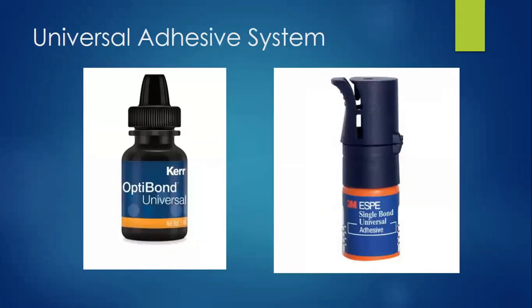Now we have the universal adhesive system. The trend in adhesive technology is to simplify, either by combining etching and primer bonding, or all in one, by reducing the application steps and shortening the clinical application time. So the aim is to provide a single product for all situations. It can be applied with etch and rinse or self-etch. It allows the clinician to have the advantage of etch and rinse on enamel and a simplified self-etch technique on dentine. It is a mild or ultra mild profile. We can use this system in either of the ways depending upon the structure we are treating.